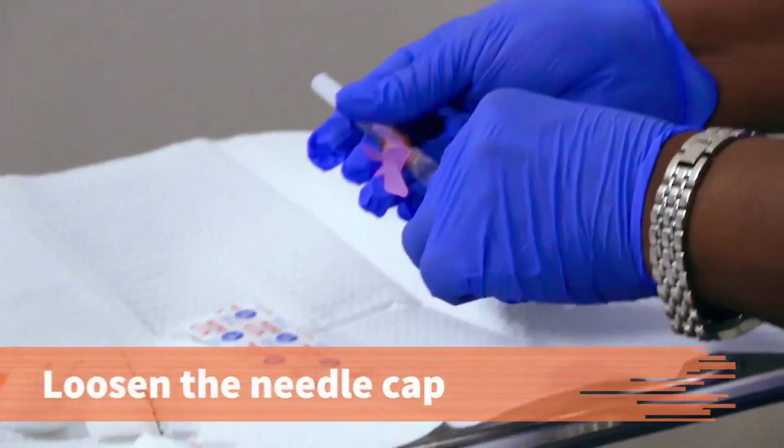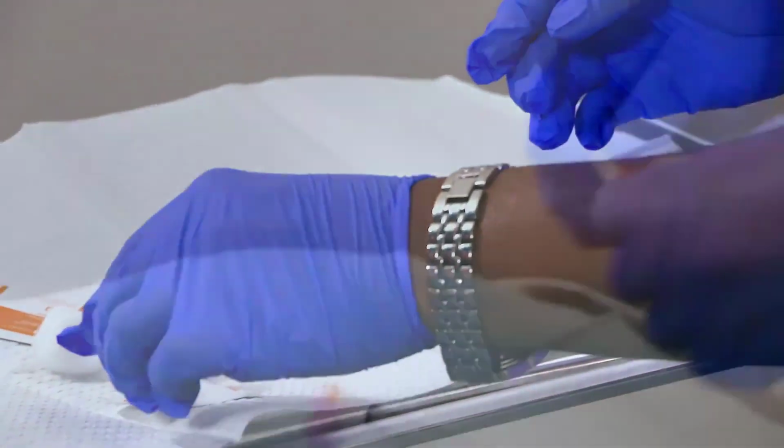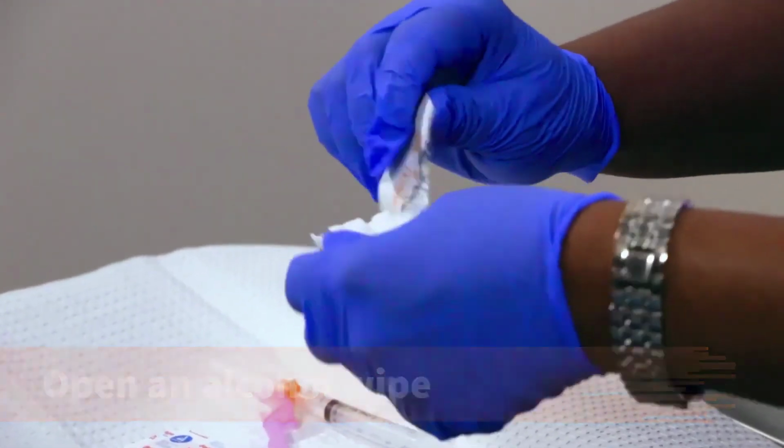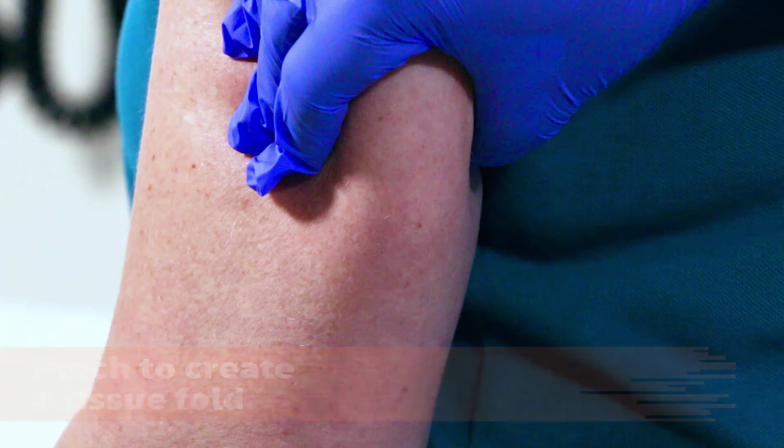Loosen the cap on the needle so that you'll be able to open it with one hand once you clean the injection site. Open the alcohol wipe. With the thumb and fingers of your non-dominant hand, grasp the tissue of the patient's posterior upper arm, pinching up the area to create a tissue fold.